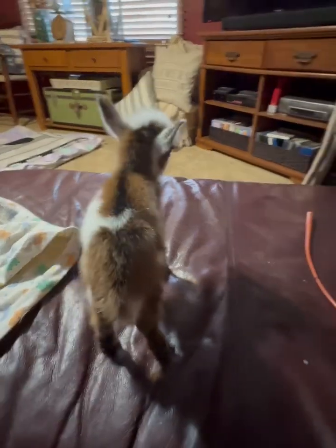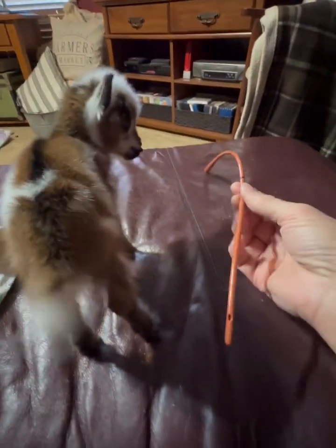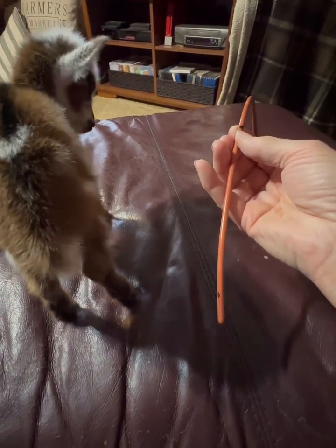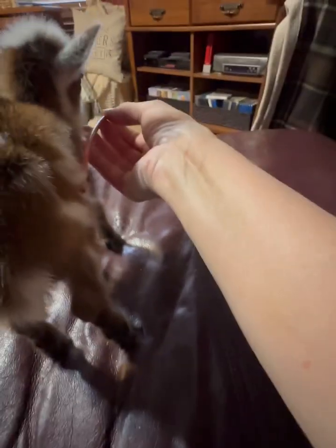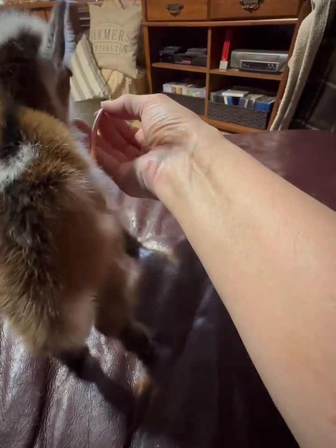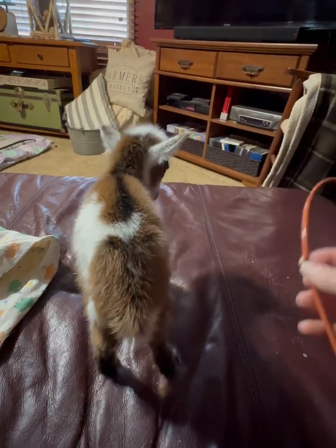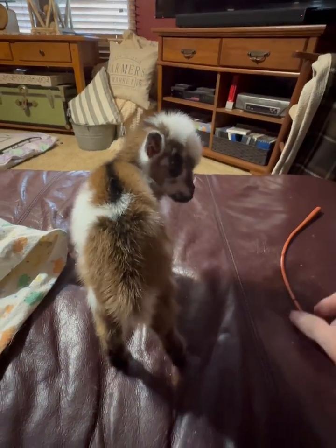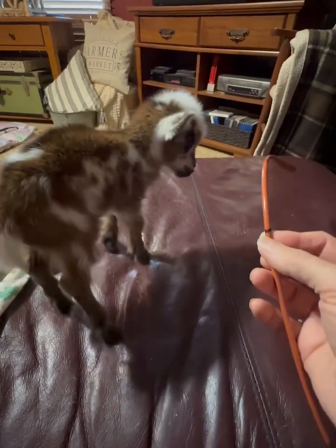So here's what we do. Here's the tube — I have marked how far I want the tube to go down by measuring from his mouth to his stomach, like that. Then I put a mark there. As I'm feeding the tube down him, I can tell when to stop by the mark.